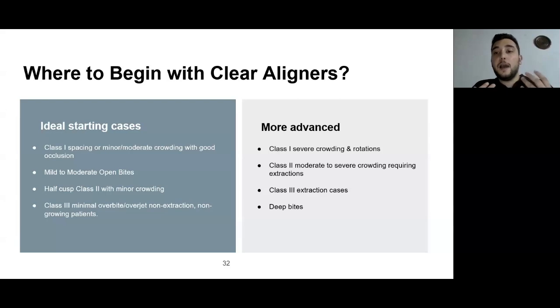Now, let's say we need the upper limit, we need around 4 millimeters of open bite closing. After doing the 3 millimeters of extrusion on the anteriors, we can also apply posterior intrusion. And we said posterior intrusion is going to help mandibular auto-rotation and a bite jump to close the bite completely. This makes open bites a predictable case because all of the movements required to correct this malocclusion are predictable movements.